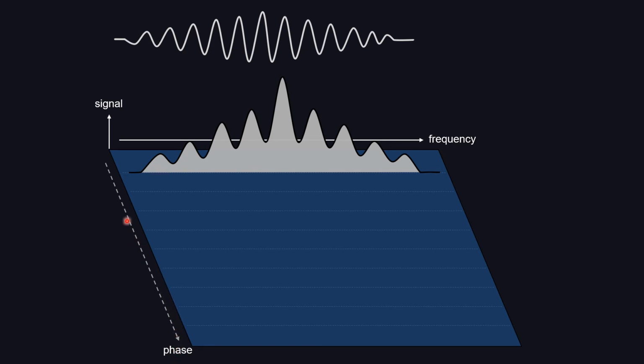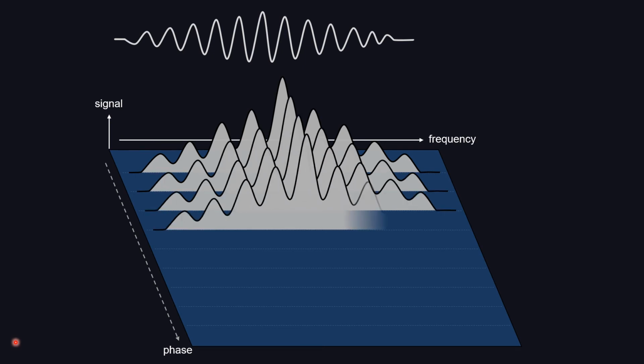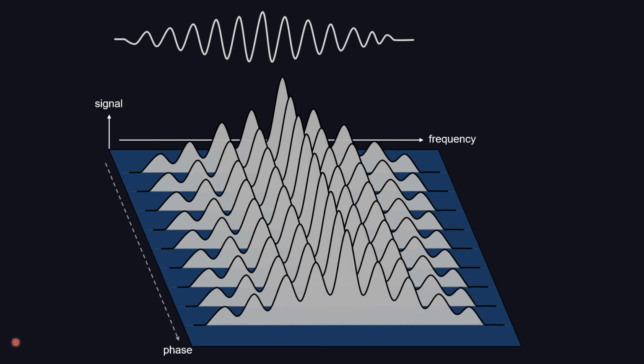Because you have not yet induced a phase shift, there's no gradient along the phase encoding direction. Every single row should have exactly the same signal profile. So at this point, you do not have a localization in the phase encoding direction. Now you induce a gradient, so you cause a phase shift. The center row will retain its original signal profile because right in the center there's no phase shift, so you have not lost any signal.